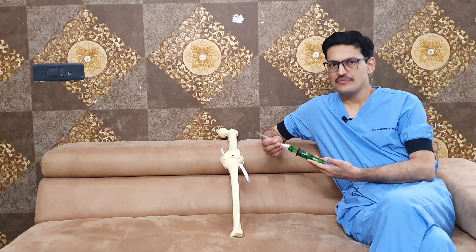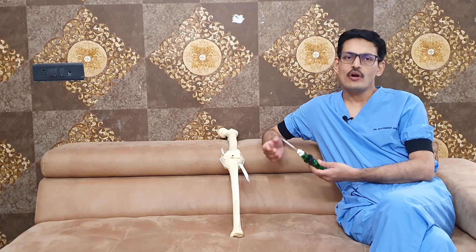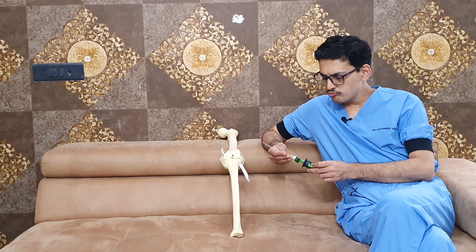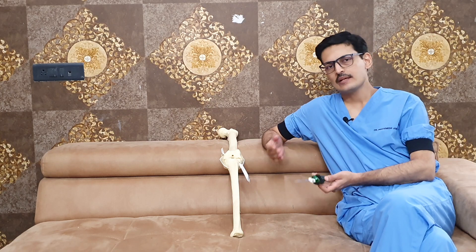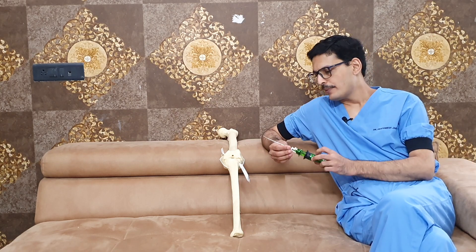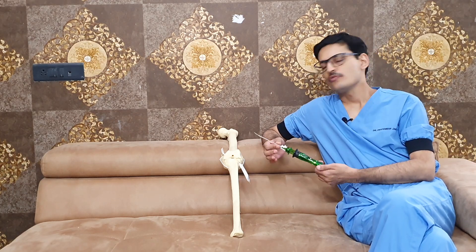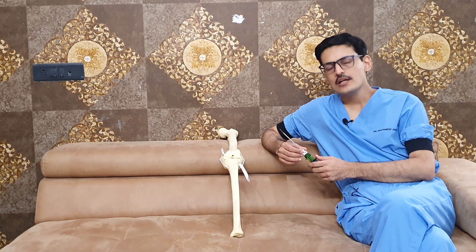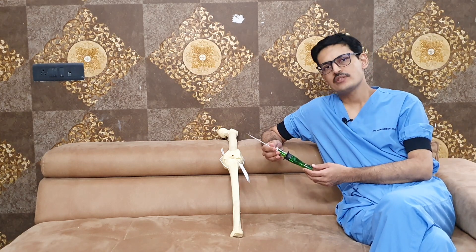Owing to all these advantages, I consider this a very good device for meniscal repair cases. The downside is that it is a little more costly compared to other contemporary devices and inside-out repair. But the advantages it gives make it a worthwhile device for meniscus repair. If you have any more questions pertaining to the Jugger Stitch device, you can write to us in the comment box. Thank you.